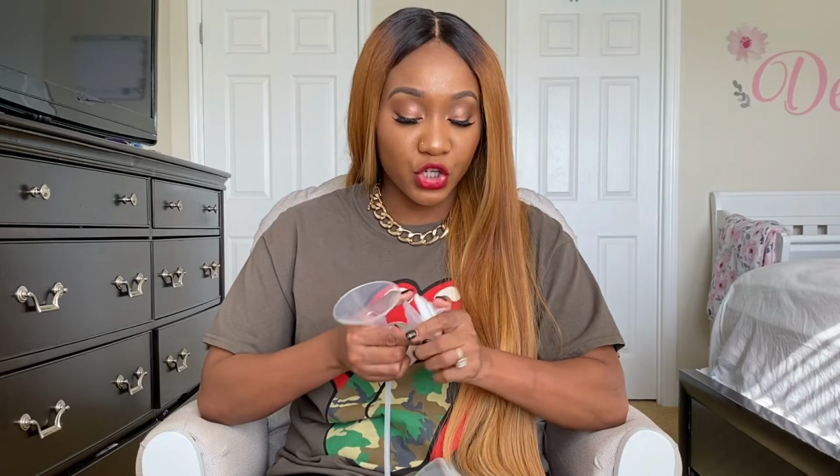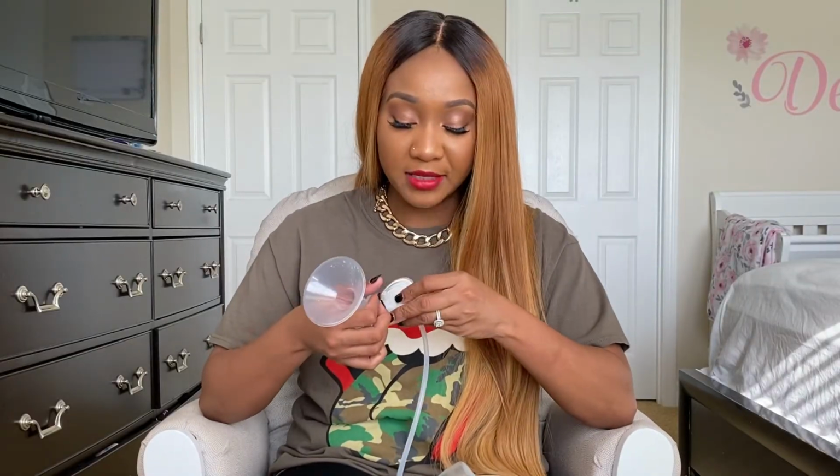It is important that when you are using your pump that you assemble it correctly. You want to make sure that your backflow protectors, everything is nice and tight and secure, because that can affect your suctioning. It's so important that you put these in. Some people don't know where these go. They go right inside this. Make sure it's nice and tight and secure.